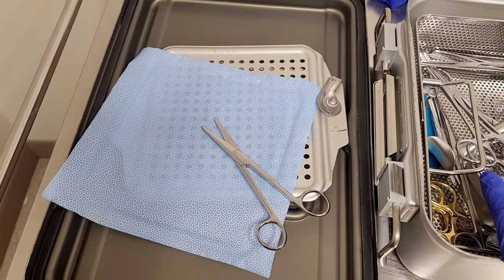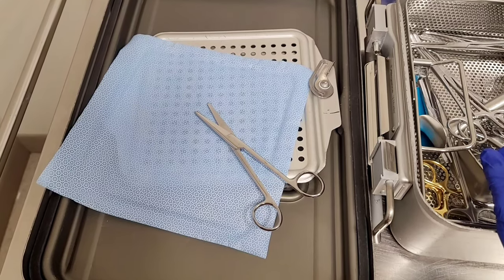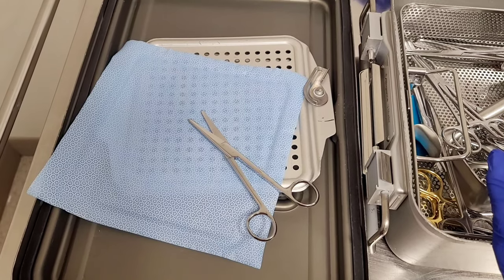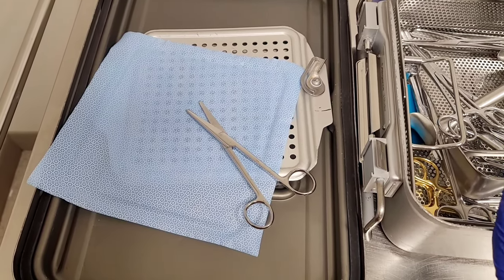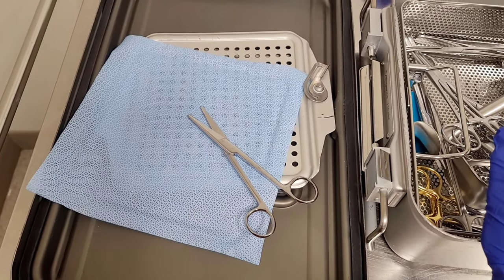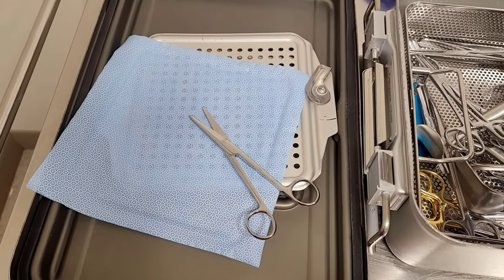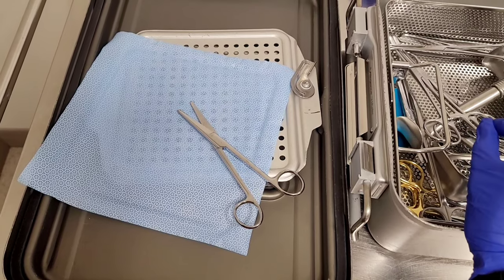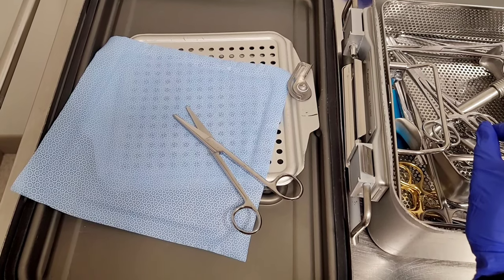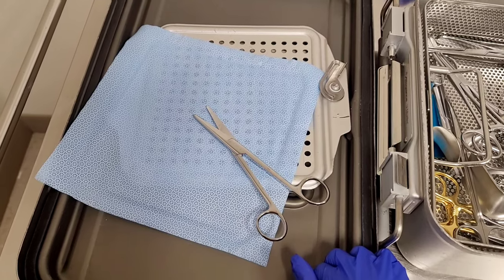Hey guys, in today's video I'm going to show you how to hold a scissor properly. I know you're thinking everyone knows how to hold a scissor, but this isn't just a regular scissor and there is a proper way to cut sutures with it. A surgeon actually showed me this. I've had residents, medical students, and even scrub tech students in surgery for the first time who don't know how to cut sutures or handle this scissor.